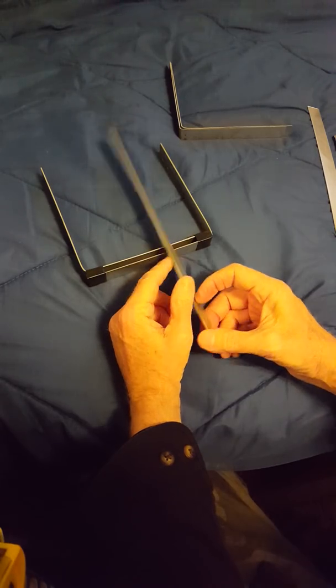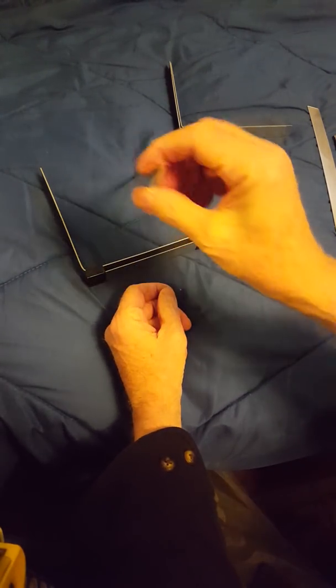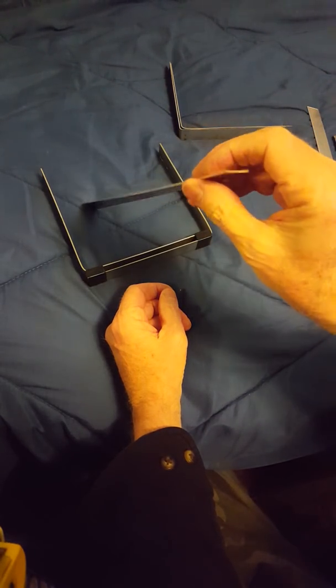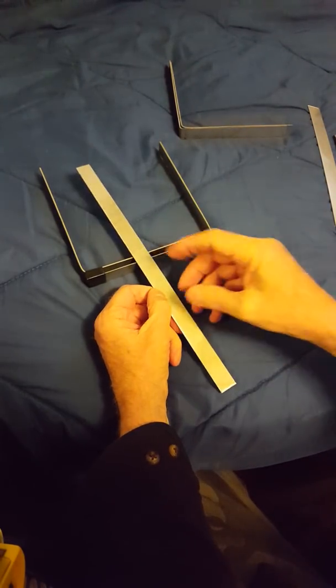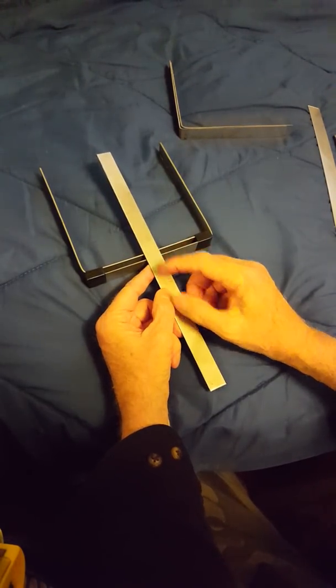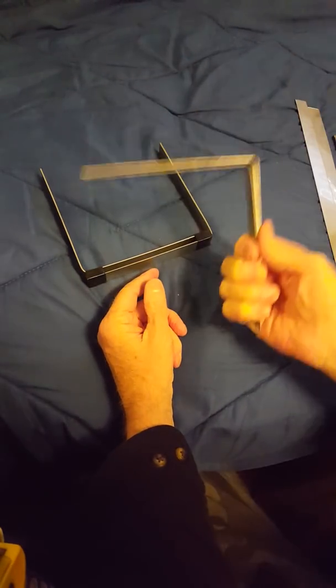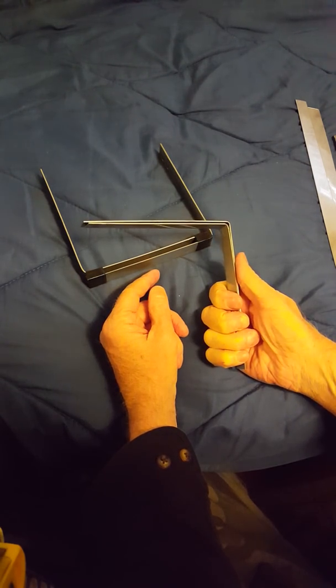The one problem with stamping though is the edges are real rough, and they also get torqued a lot. So you have to get in there with wrenches and try to straighten the things out. You can pay more to have them cut out and you don't get all that mess. You can also pay to have them bent and save yourself the bending of them, unless you've got an anvil and you've got time to do it that way.